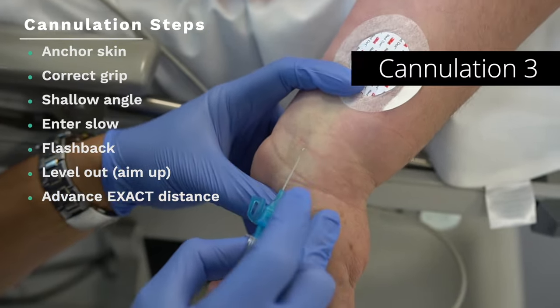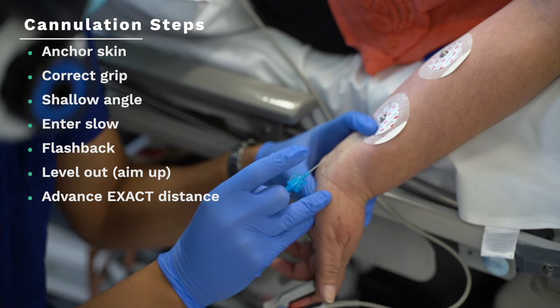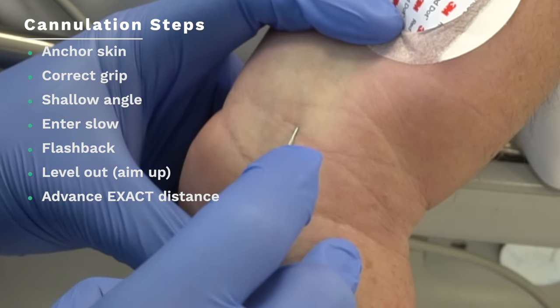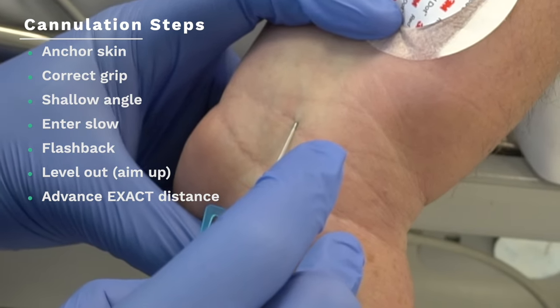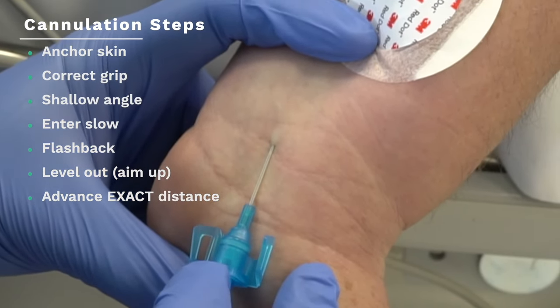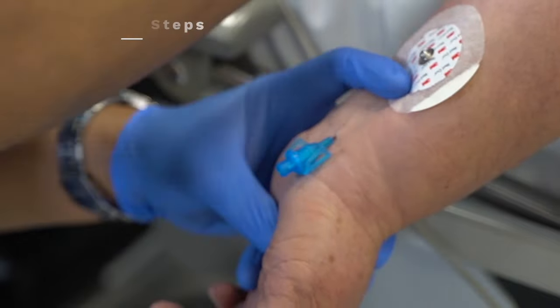This is one of those difficult cannula videos I've already got up on YouTube — I'll put a link to that as well. You'll often be told that the wrist is not a place to go, and it's almost always true: the wrist is not that comfortable for a patient and the veins are very small and fragile. But sometimes that's the only vein available, and for a short procedure like cataracts, it's completely reasonable to use it temporarily. In some patients you can find really large, stable, non-fragile veins there and you can keep the cannula for as long as the vein holds up.